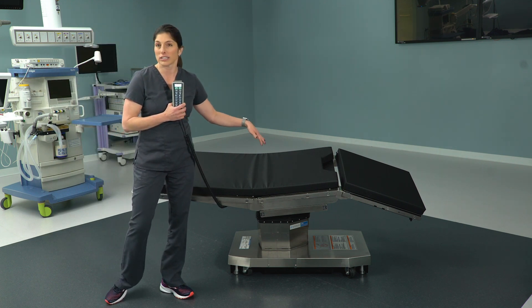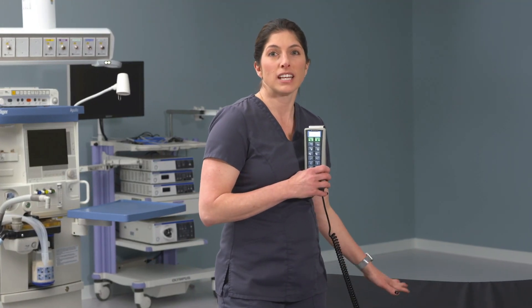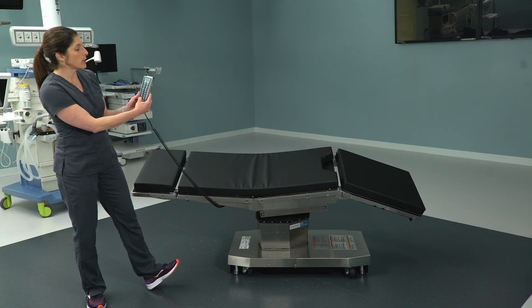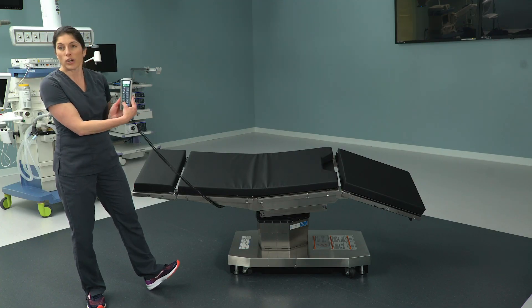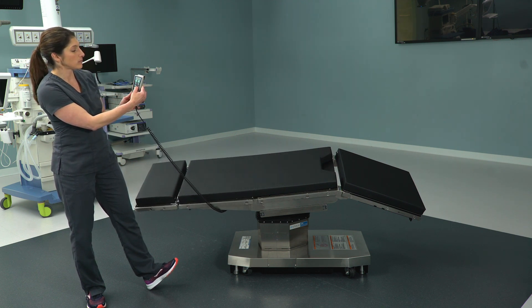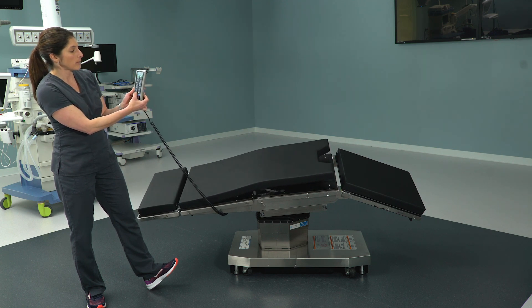Unlike the 3085, you cannot cause damage to the surgical table by one piece colliding with another. It does not detect foreign objects, but it will prevent the table from colliding with itself. So when we try to raise the kidney bridge, we know we have to go back down first in order to finish that function — press back down, get the back out of the way, and then go back to kidney up.